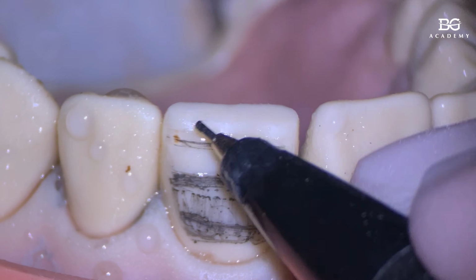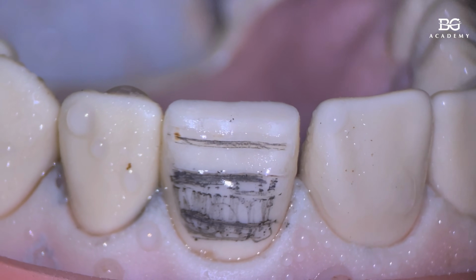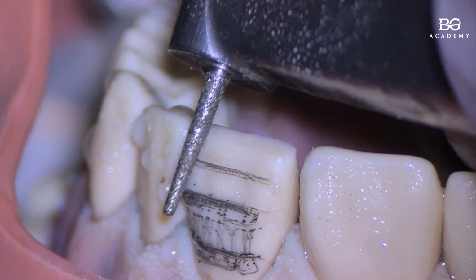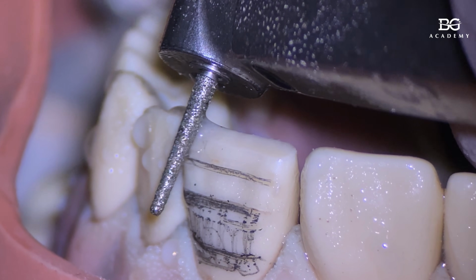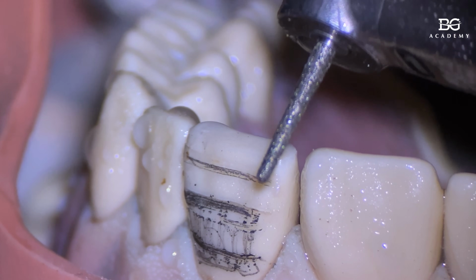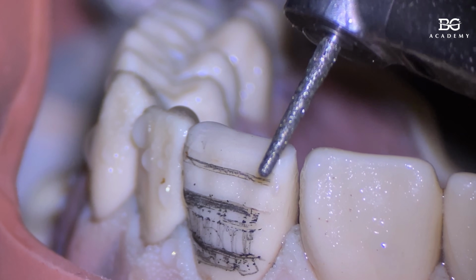It's not just this area, this zone, because there is another mistake that many people make. They just place the bur like this. Let me just move the head of my patient to the side and you will see what I mean. Yeah, like this. And instead of plane reduction, they do a bevel and a very thin incisal edge. So that's not a good thing.